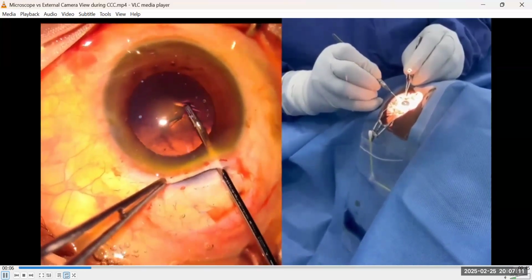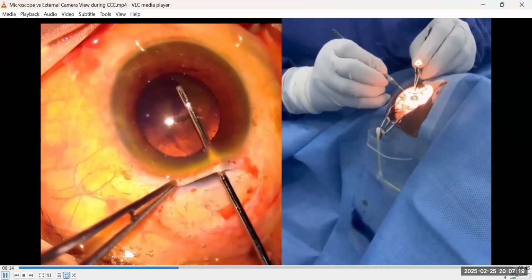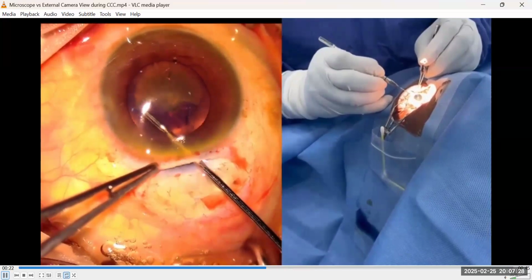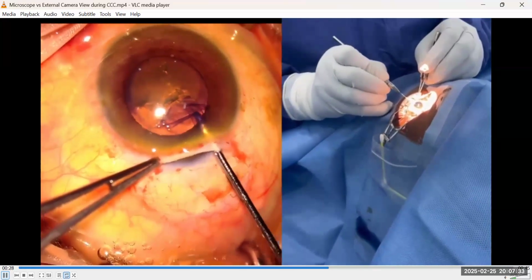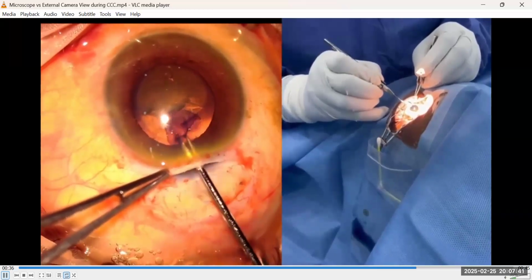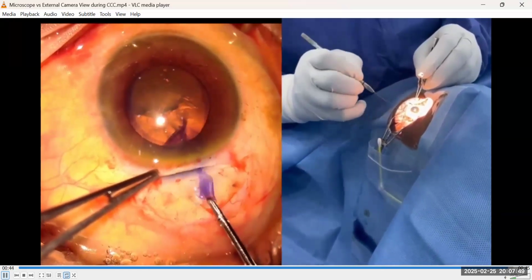So I found a flap, grabbed it. Oh, it went beyond my control. So instead of doing circumferential, I did more of centrifugal. Centrifugal, centrifugal. All right, pick it up again. Centrifugal, centrifugal. Change fulcrum, centripetal, centripetal. Now, it was difficult to pick that flap. The more I tried, the more I was getting apprehensive. All right, centripetal. Thank you, everybody.